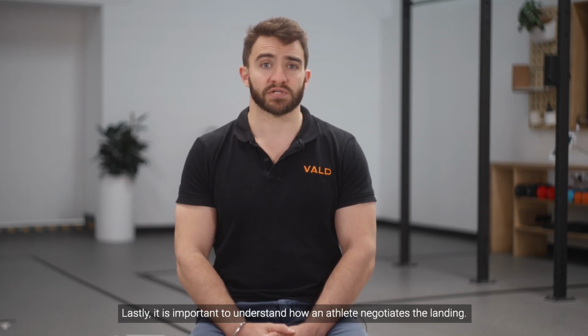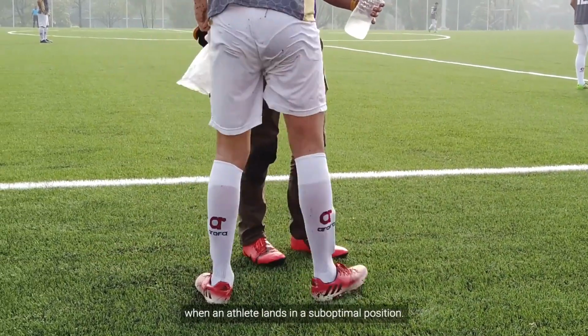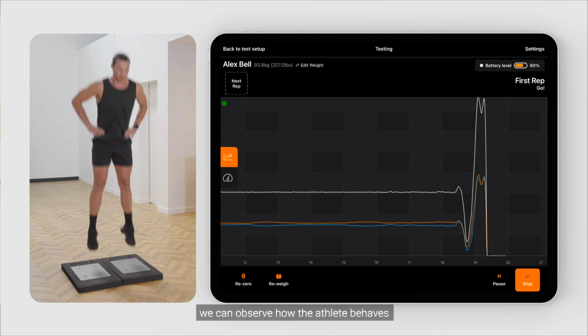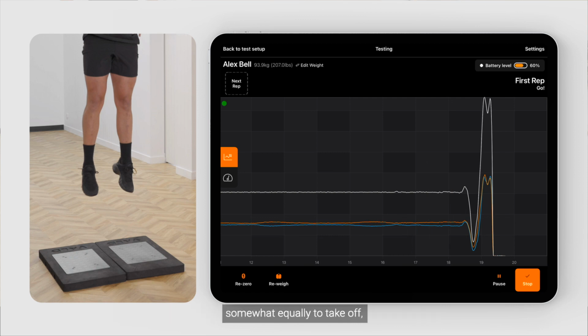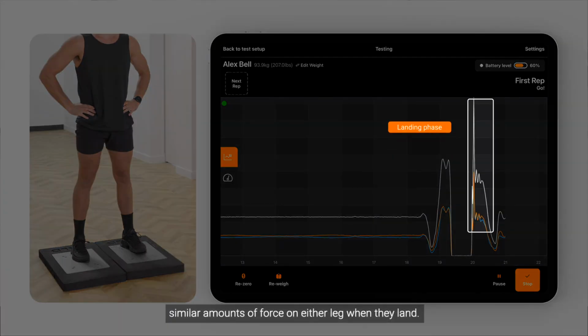Lastly, it is important to understand how an athlete negotiates the landing. Injuries in sport frequently occur when an athlete lands in a suboptimal position. During the last key phase of the CMJ, the landing, we can observe how the athlete behaves when he or she contacts the ground. Just as the athlete is expected to be capable of using both legs somewhat equally to take off, they should also be able to produce similar amounts of force on either leg when they land.